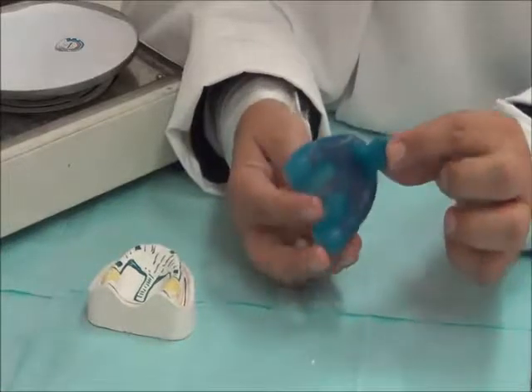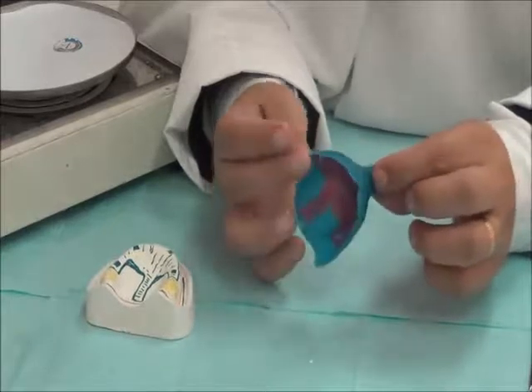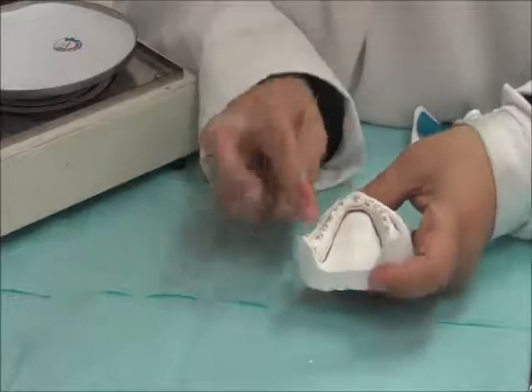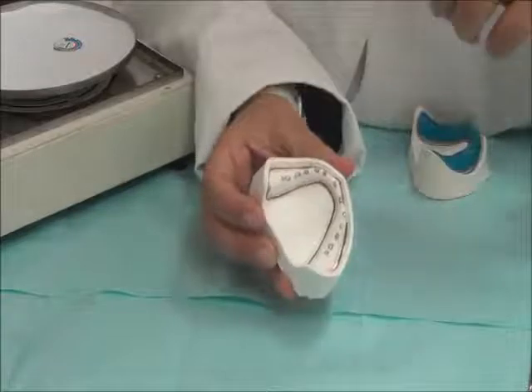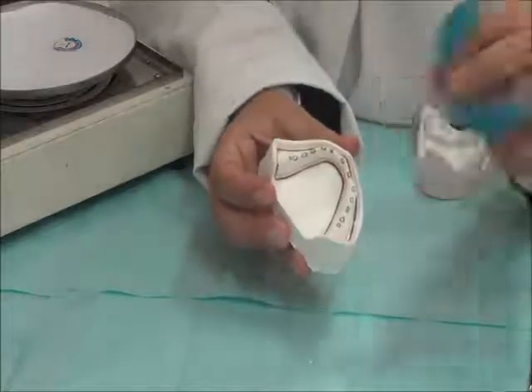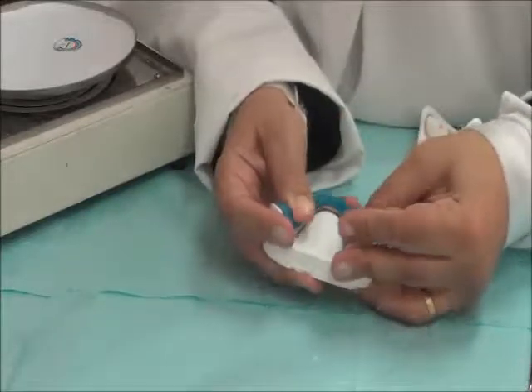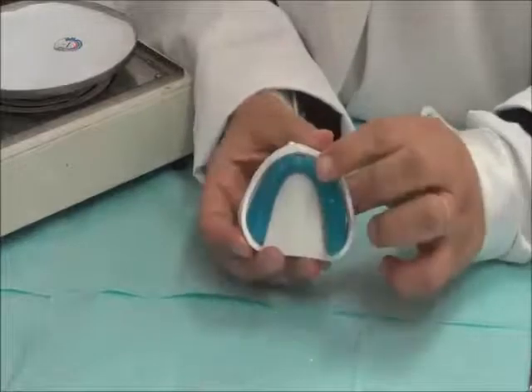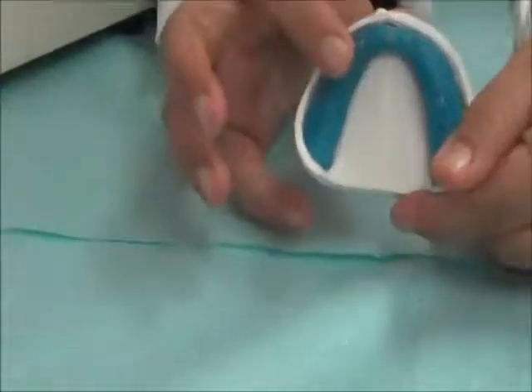So this is for the upper. We're going now to do the trimming step. For the lower, you have drawn the outline and then the outline of the tray. Then we're going to adapt the tray light cure material over the tray immediately and light cure it. And we're going to place the holes in the light cure material or acrylic base material before curing it.